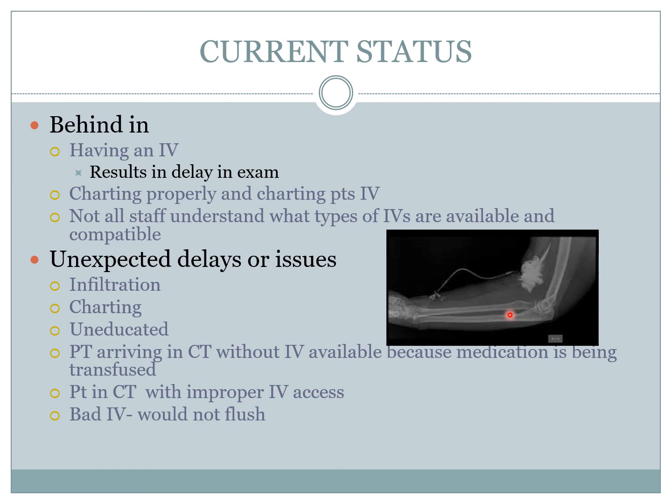Another thing to really consider is, let's say this patient came, IV infiltrated up here, but now the nurse put a new IV in the hand because they found a new IV. They weren't able to get a new one on the AC. You can't use the other arm. And so the nurse put an IV on the hand. Is that acceptable or is that not acceptable? Let's think it over. IV in the hand. Infiltration in the upper arm. Contrast going through.